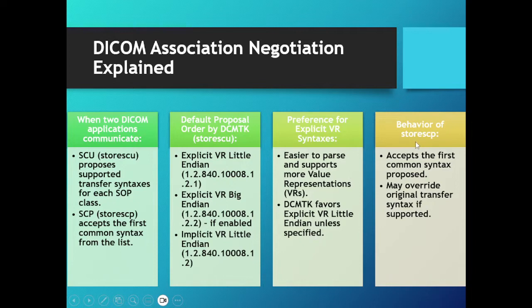And the behavior of storescp is to accept the first common syntax proposed. And in the example I showed earlier, it overrides the original transfer syntax because it also supports the explicit VR Little Endian, which is the first one proposed by storescu.